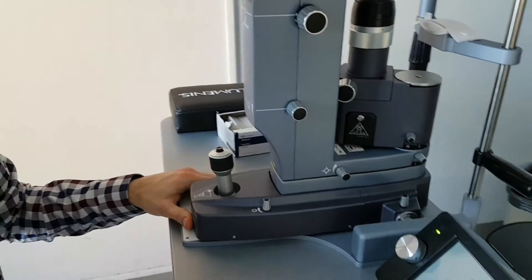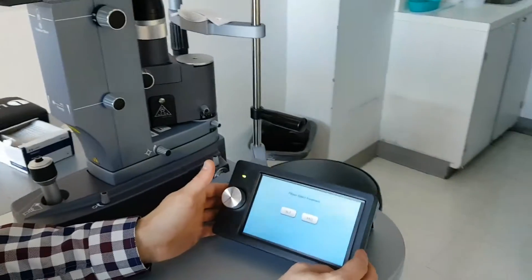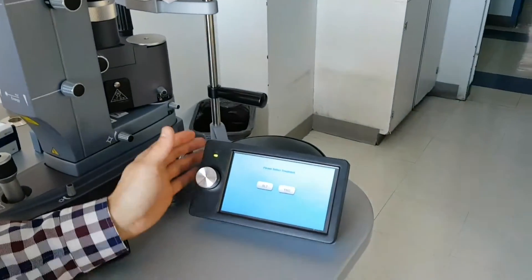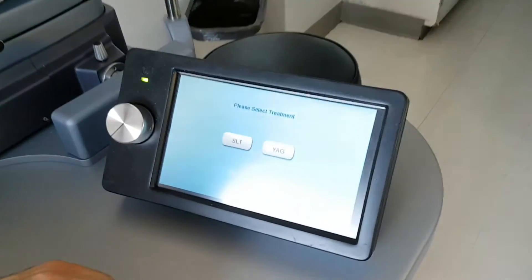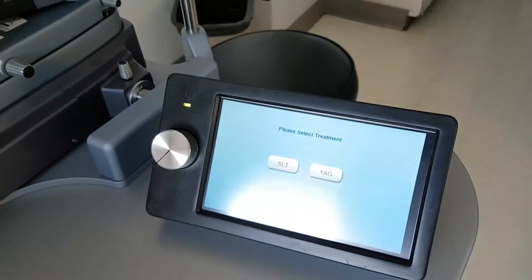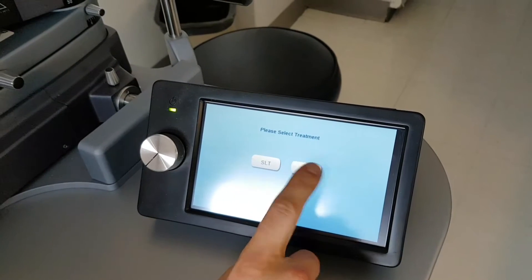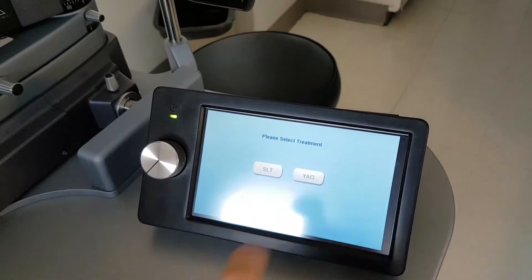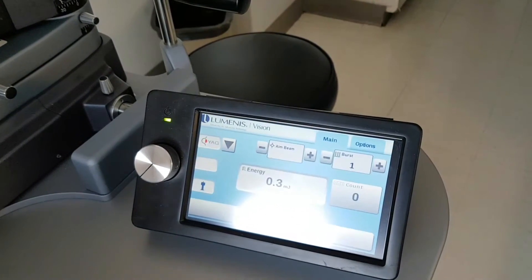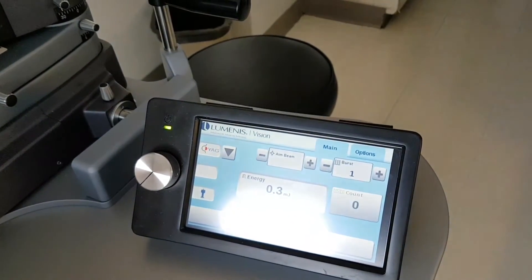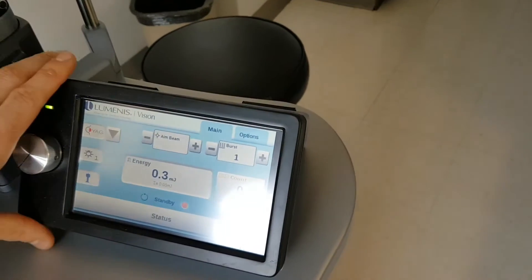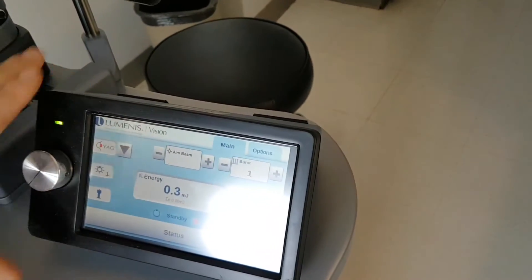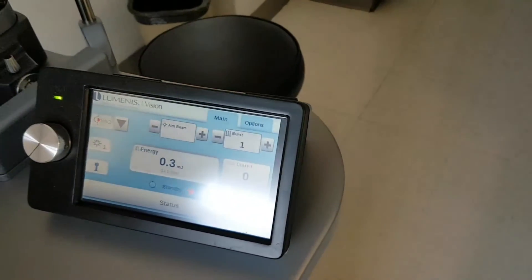Once the laser is powered on, you have a selection of either SLT or YAG. We're going to start off with the YAG. So this is your main screen for treating with the YAG laser.